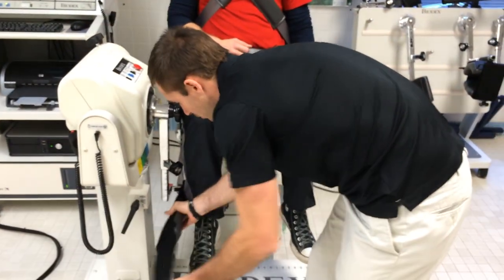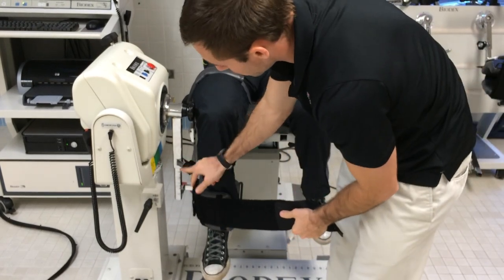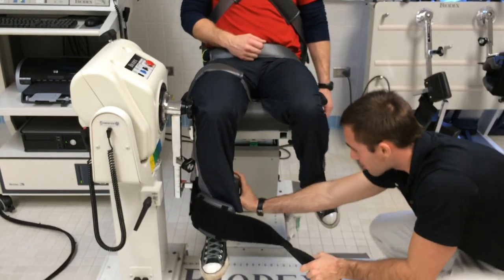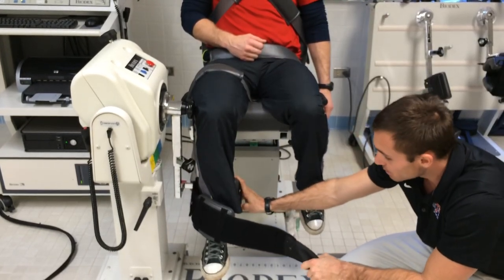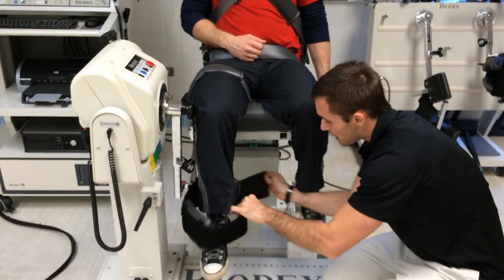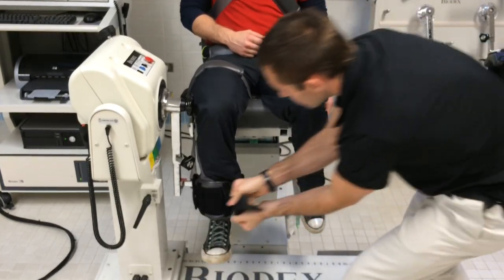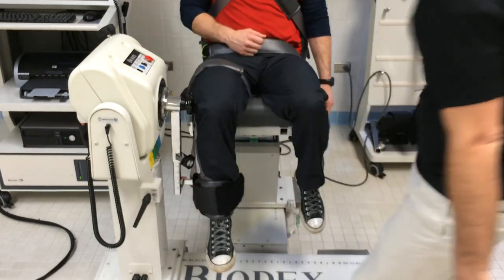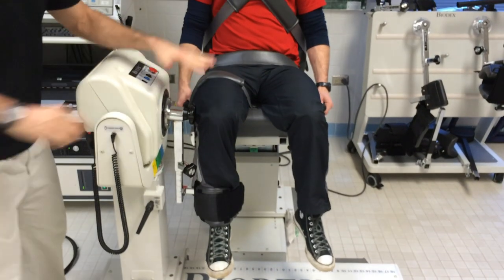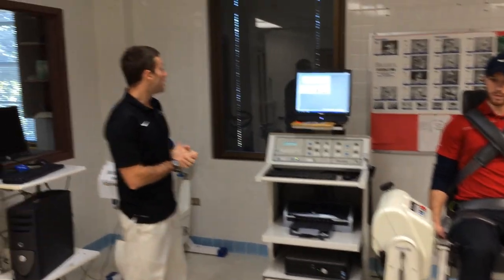We see our ankle strap right here. It just comes along the top of the foot. This can turn, which means that we can bring this bar up or down. What we're looking for is that the pad sits right on the back of the ankle. Depending on the subject height, this will have to be adjusted. His looks pretty good. So we'll just strap him in here. I'm going to pull tight and then lock it in. Does that feel okay? Okay, so now he's ready to go. He's all locked in. We're ready to refocus back on our computer.